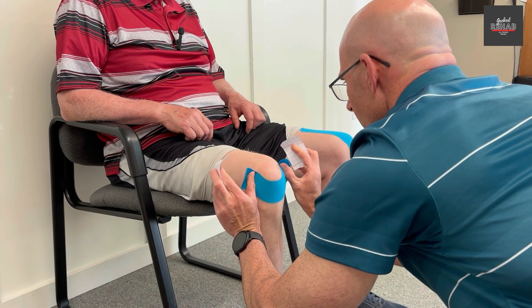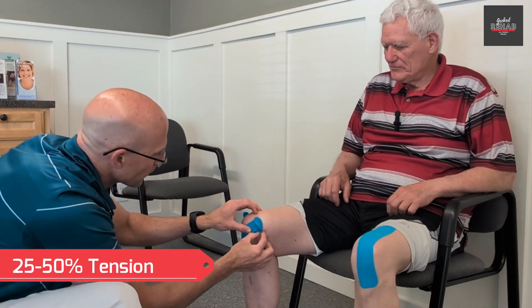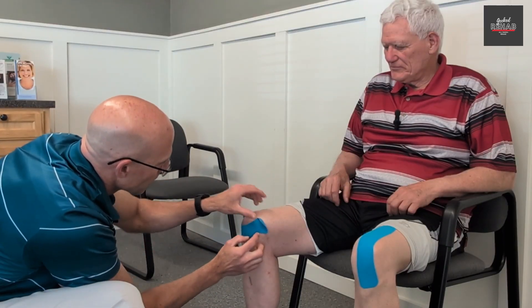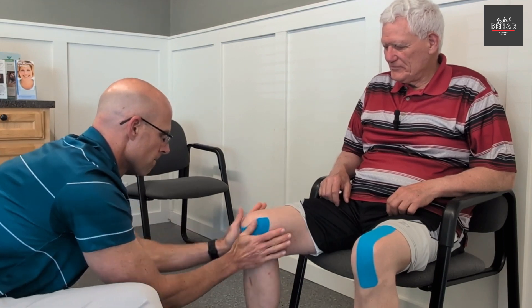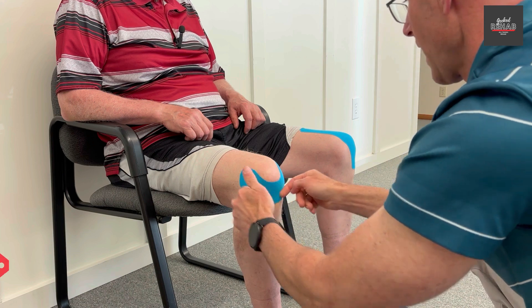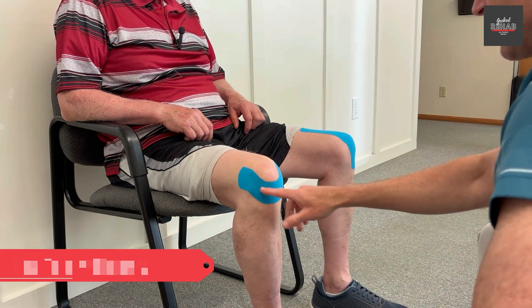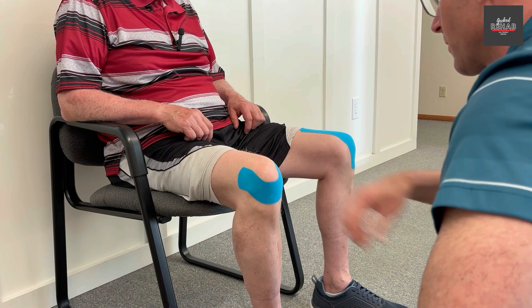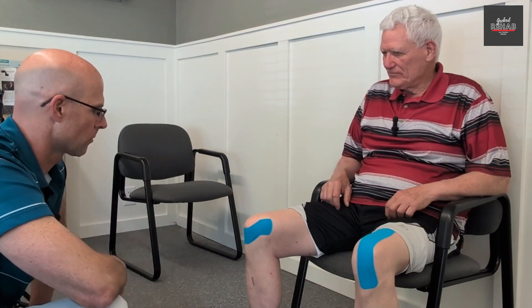You can go anywhere between 25 to 50 percent tension, and at the ends there's no tension. And you see it's a happy face — they're happy. That tape takes away the tendonitis, lifts that inferior pole of the patella, and that really helps with a lot of the pain control.